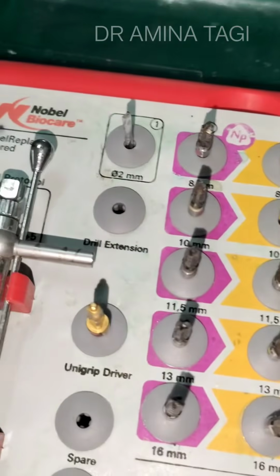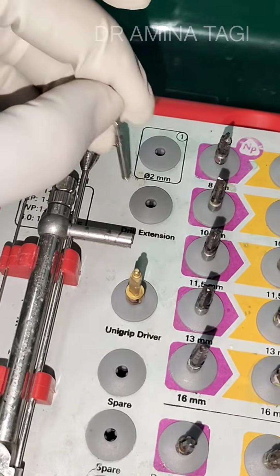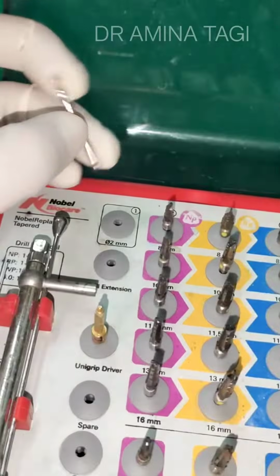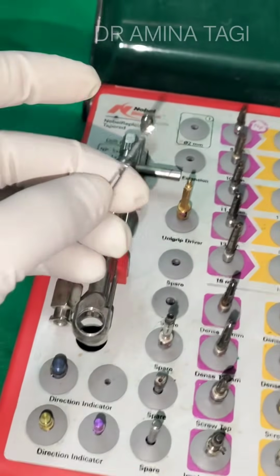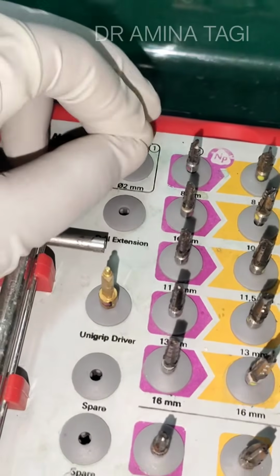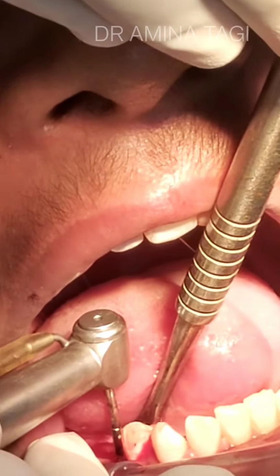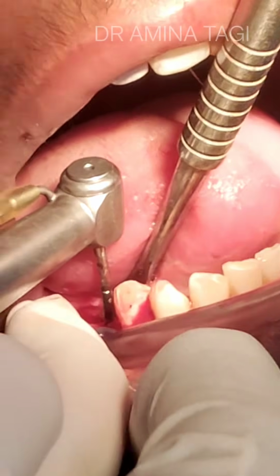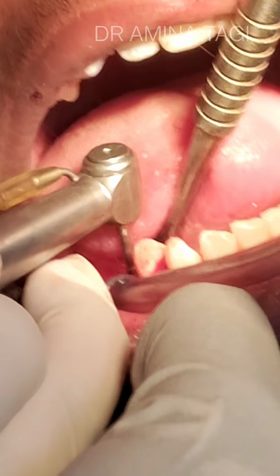Now we have the twist drill, which is basically the pilot drill. This is 2 mm in diameter. Everything is written in the implant kit, you don't have to worry. This is also known as the universal drill because in every implant surgery we will definitely be using the pilot drill. This drill is very important because it acts as a guide for subsequent drills.